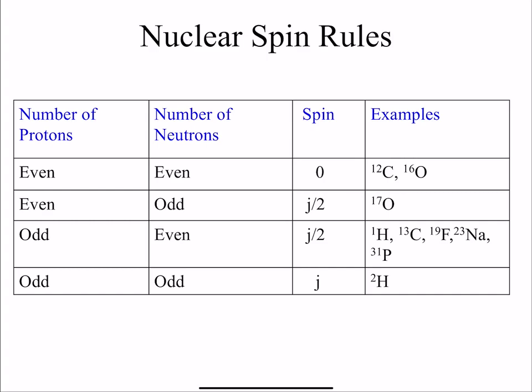The other thing we need to know, and we're lucky in this, is that the hydrogen proton has spin that's detectable. Typically spin 1/2 is detectable, spin 0 is not. These are the ones we can measure with MRI, and the most prevalent one is the hydrogen proton. But we can also look at fluorine-19, sodium, phosphorus, or O17, which is not a natural isotope. We're very lucky that the hydrogen proton has spin 1/2, because otherwise MRI just wouldn't be possible.